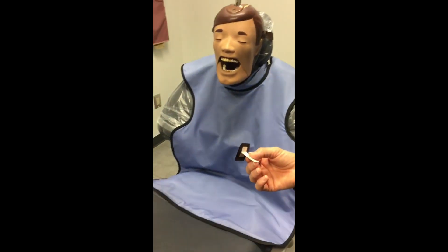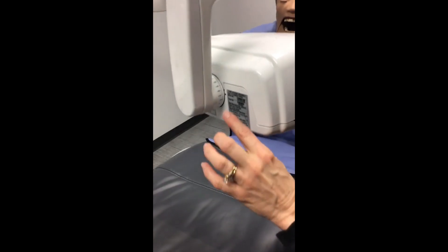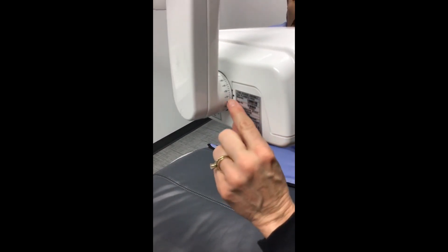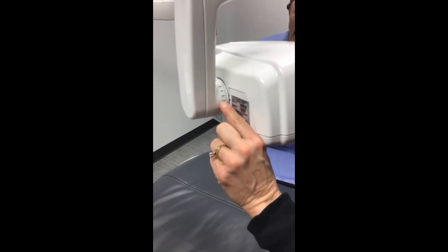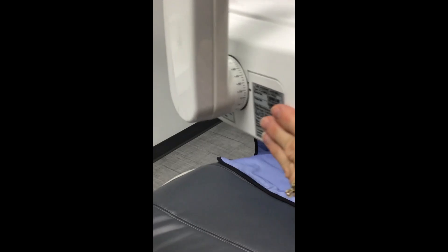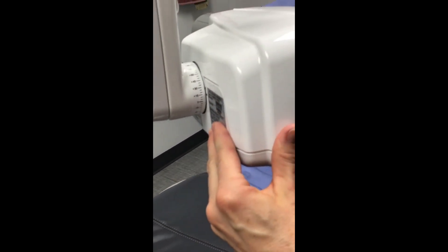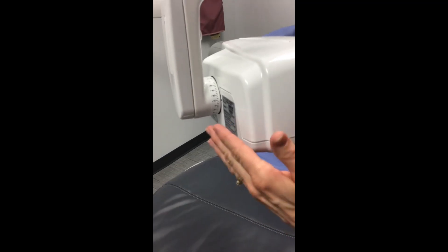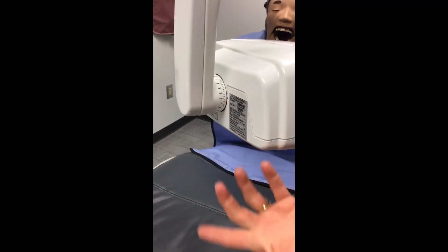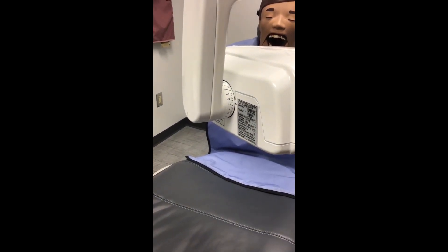Go ahead and set your vertical on your tube head. For your bite wings, it's going to be between 10 and 15 degrees. On this unit you can see a positive 15, which means your tube head is pointing down, and there's a little dot that tells you where it sets. All your X-ray tube heads have a gauge on them; it will look different depending on the manufacturer. Go ahead and set your vertical.